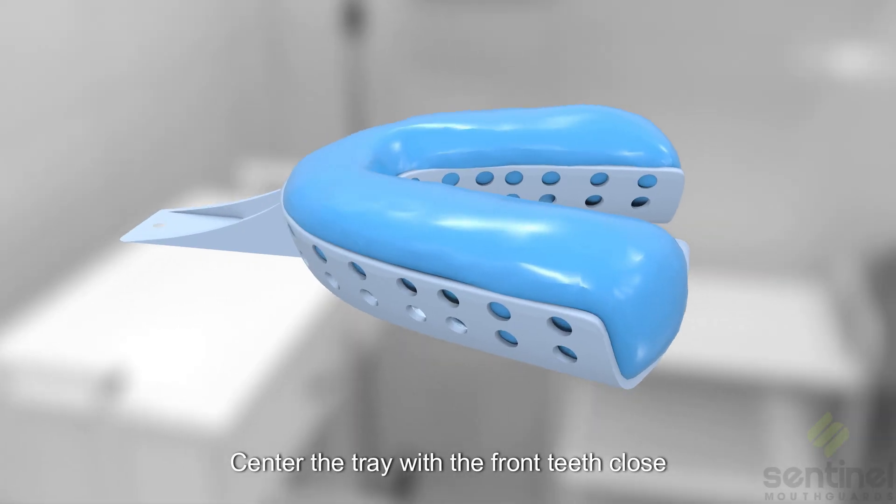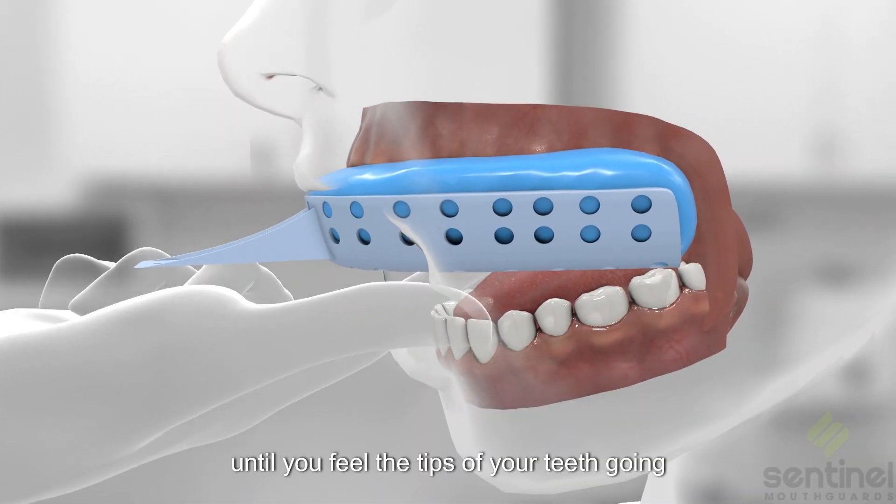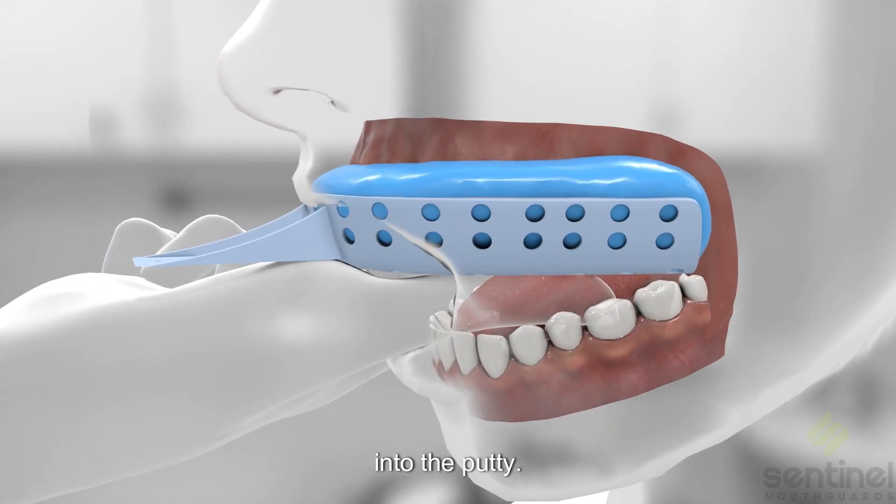Center the tray with the front teeth close to the rim of the plastic, but not hitting the plastic. Then firmly press the tray into your teeth until you feel the tips of your teeth going into the putty.